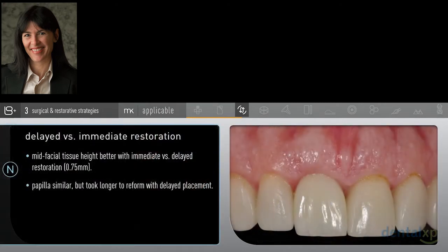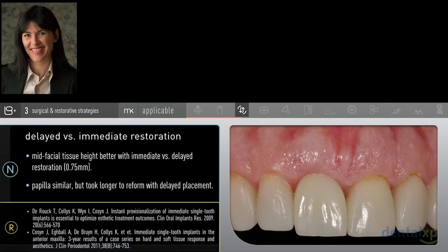It's kind of like, although I'm not talking about it today, I look at platform switching. Everybody talks about bone. Well, to me, platform switching's huge benefit is it leaves me room to make lots of soft tissues, and thick, robust tissues are my key to long-term success. So when we provisionalize, here we're looking at several months later, my goal in provisionalizing is, sure, making a happy patient because they've walked out with a tooth, but my goal is to support the tissue architecture, define the papilla, and keep it captured at the level where it came in when the patient was losing that tooth.